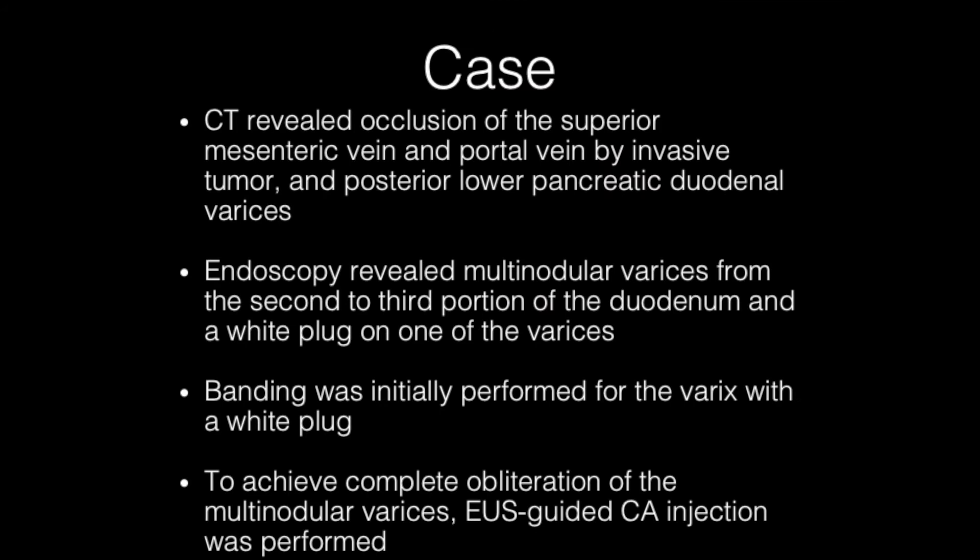Endoscopy was performed and multi-nodular varices from the second to the third portion of the duodenum were revealed. One of the varices happened to have a white plug. Banding was initially performed for the varix with the white plug. We decided the treatment was inadequate, so we decided to perform EUS-guided cyanoacrylate injection in order to achieve complete obliteration.